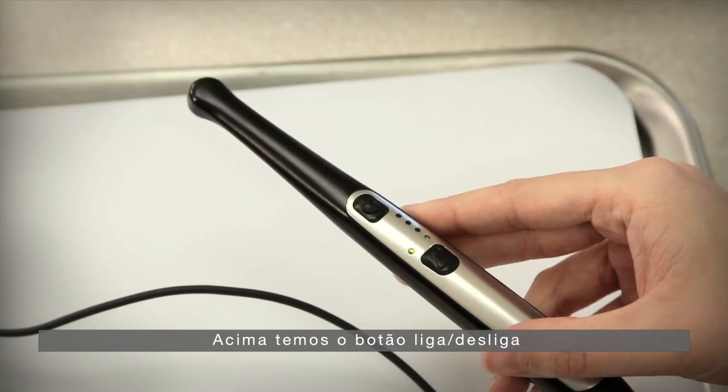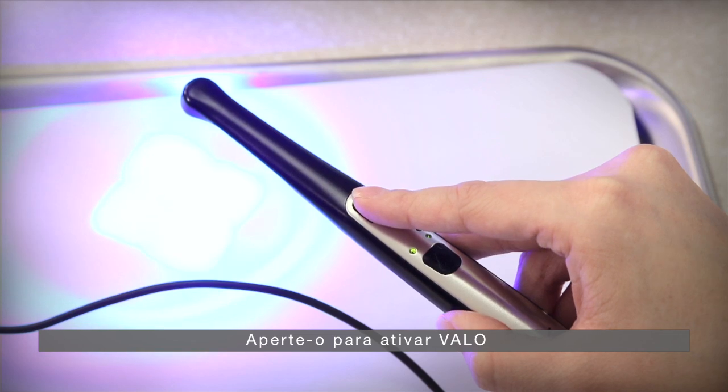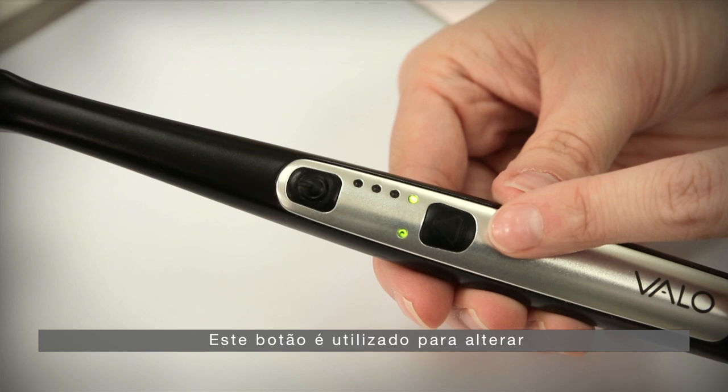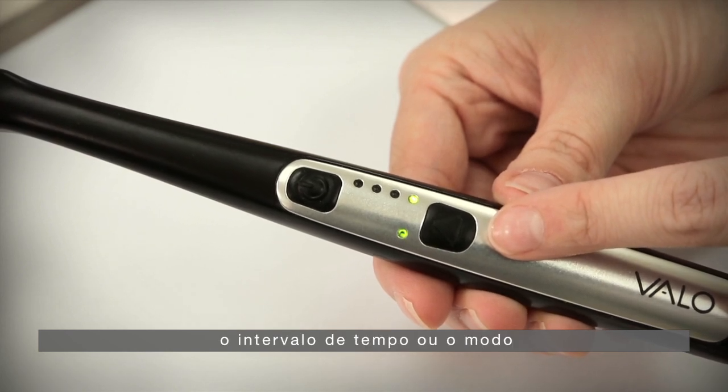The top button is the power button — press to activate VALO. The bottom button is the time and mode button, which is used to change the timing interval or the mode.